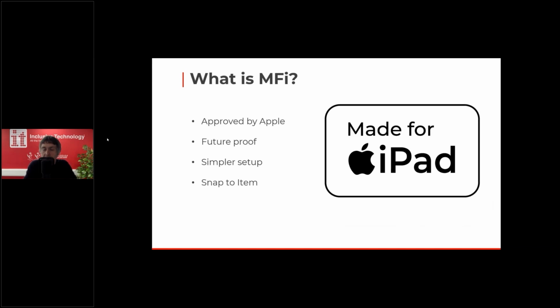Why is that of benefit? Well, a few things really. Number one, it's future proof. If there are any changes to iOS, I know that's always a concern with some of our customers. What happens 3, 4 years down the line? Well, that's okay for Eyetuitive. It will always be supported because it's got that MFi.